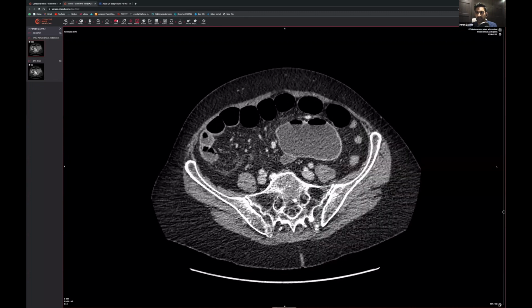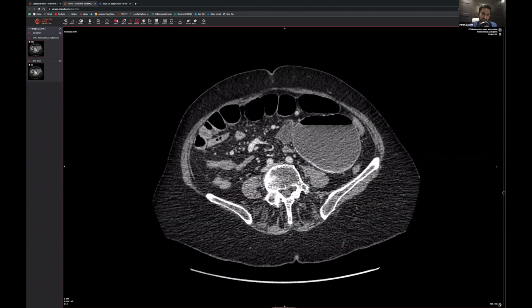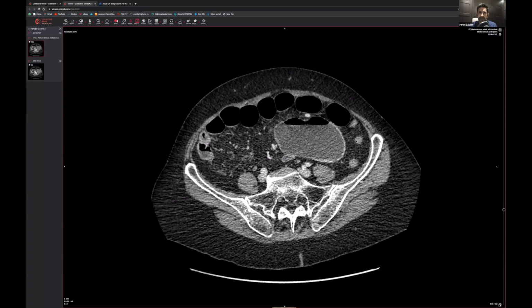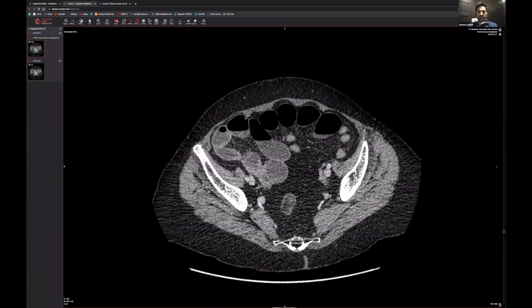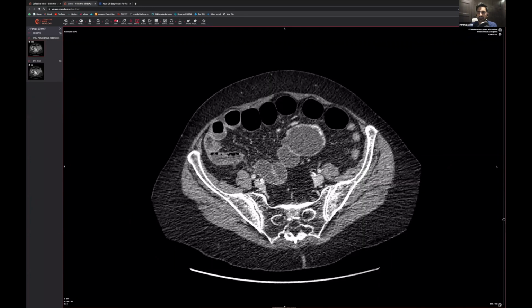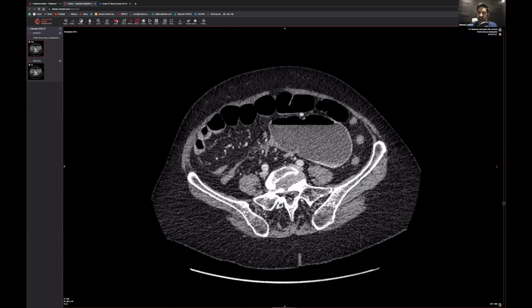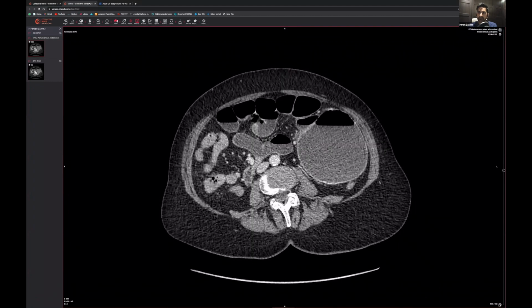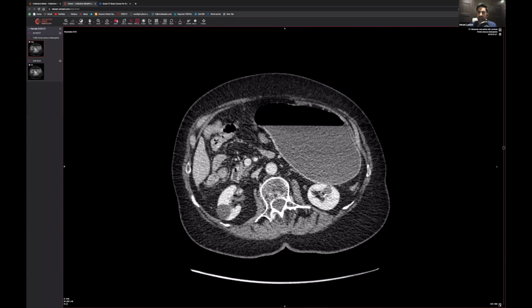I think this is going to be the one coming up this way. Oh, look, and we join up here in the region of the splenic flexure, and it seems to kind of dip down again. Can everyone see that? Dipping down. Okay, so we're curling back up again. So quite unusual for the descending colon to do that. But anyway, we're here now all together. Coming up here to the splenic flexure, coming up to, where's the spleen? Okay, we're almost there. Okay, we're here.